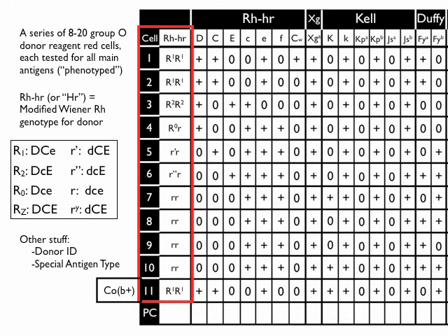Where you see, for example, that the donor from cell 11 is positive for the Colton B antigen. Okay, important to know. In addition, it's important to know that the bottom row of a panel is usually left blank by the manufacturers, and it's reserved for the patient phenotype. Phenotypes are used at the end of this process.